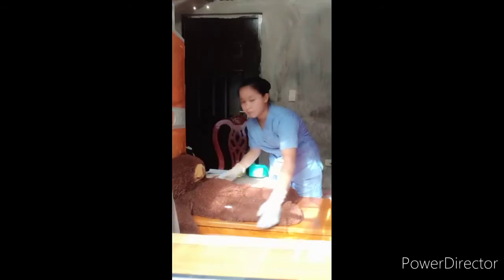And now, let's proceed to the planning. First, let's identify the expected outcomes. And next, let's assist the patient to an appropriate position. And then next, let's position the pulse oximeter on the patient's finger, take a reading, and leave the oximeter in place. So, let's place the pulse oximeter.